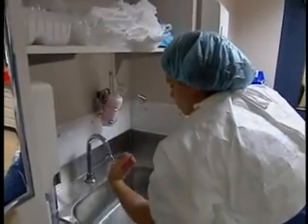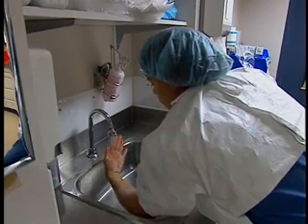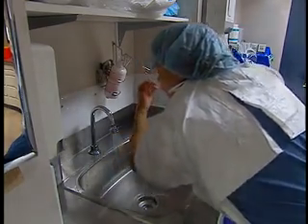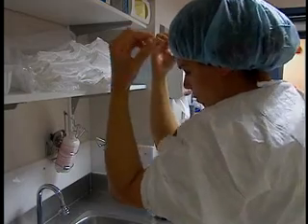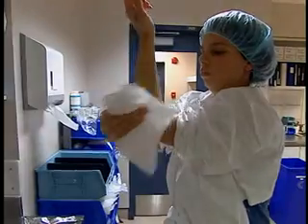Make sure that you keep your hands higher than your elbows during the washing. Rinse thoroughly using abundant warm water, one hand at a time, starting with the fingers and moving up to the elbows. Let the water run down to your elbows. Keep your arms away from your body. Completely dry each hand under hot air or with paper towels, starting from the hand and moving towards the elbow, without going back over the parts that have already been dried. Don't forget the spaces between your fingers.